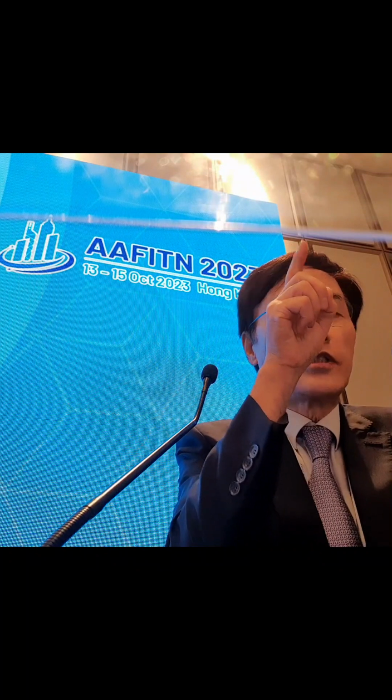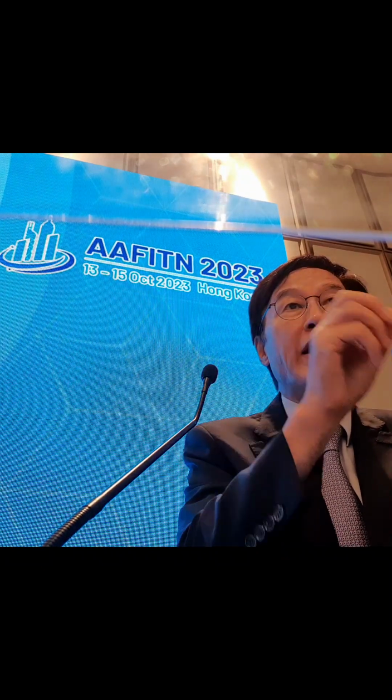So between the stent and the opposite wall, this kind of vertical framework would be necessary to make a rather rigid frame, to protect against inflow into the aneurysm. Then the vacant area may remain stable even with a remnant at the neck or even part of the sac. This ugly aneurysm looks like this after 3 months. Further follow-up would be necessary.